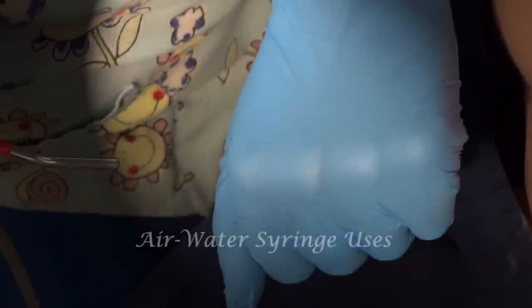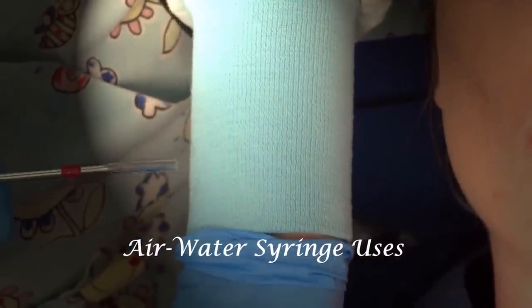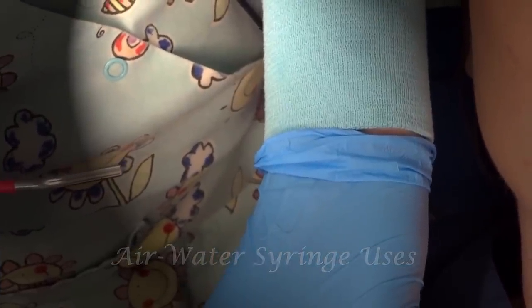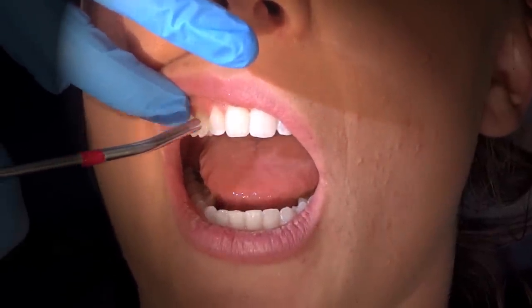The water syringe has many uses, but it should never be used without a test spray first. I'll either spray it on my pant leg or just a little bit on my arm. It should never be used on a patient without giving them a warning — I'll usually say something like 'I'm going to spray a little bit of air first,' and then I'll slowly spray that air in their mouth.